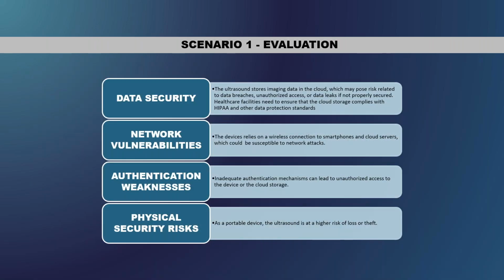Next slide. A couple of issues with that: yes, that's great that the ultrasound can be accessed through your phone, but what they were telling us originally was that it's any phone. There's no security, no isolated network, no limit to who has access, and no authentication method. So there are a lot of data concerns. Although it's easy for the clinicians, it is a problem for anybody in charge of the network, because you're worried about data security. Who has access to that data? It's being stored in a cloud environment, so that's another issue, because who has authentication to the cloud environment? Is there a backup solution?